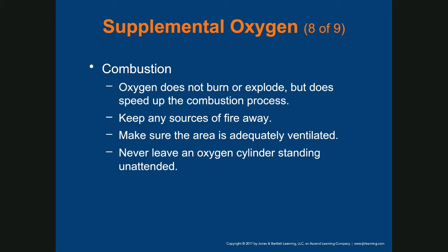You don't want a cylinder standing up in the field, because no matter what you tell people, like, don't stand so close to that cylinder, somebody's not going to listen and bounce that cylinder over. And you don't want that stem to crack. That's 2000 psi if it is filled with oxygen.